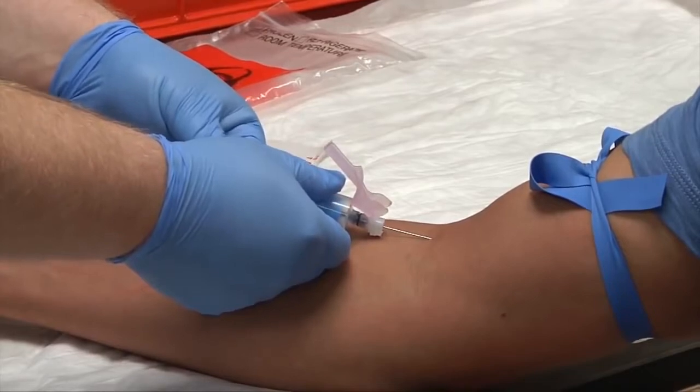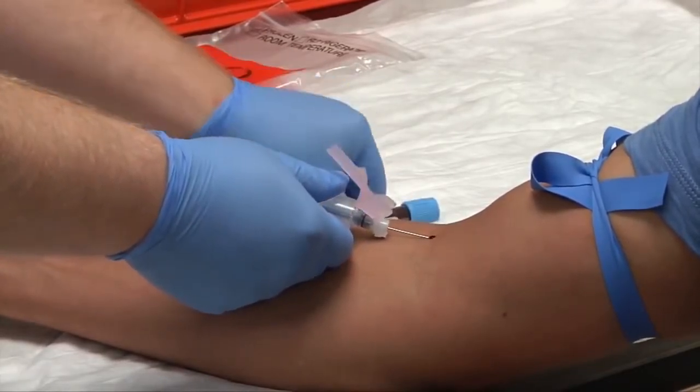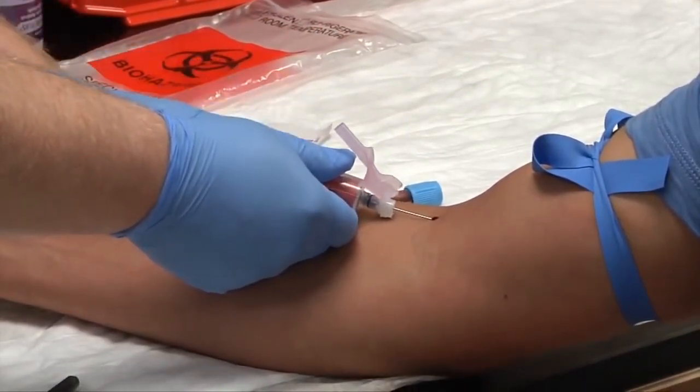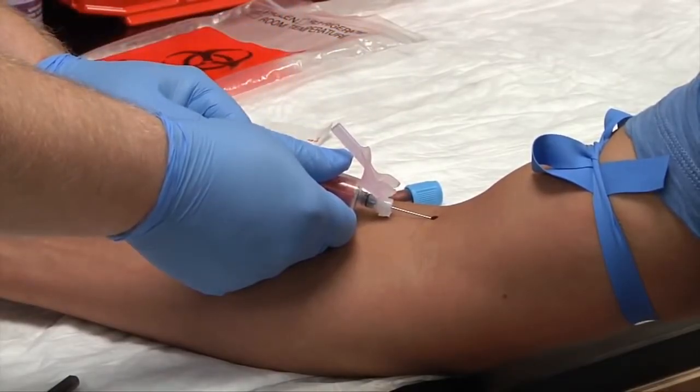All right, so that's full. We'll go ahead and disengage this tube. Insert the next. And sometimes a little blood will come out around the edges. That's okay too.